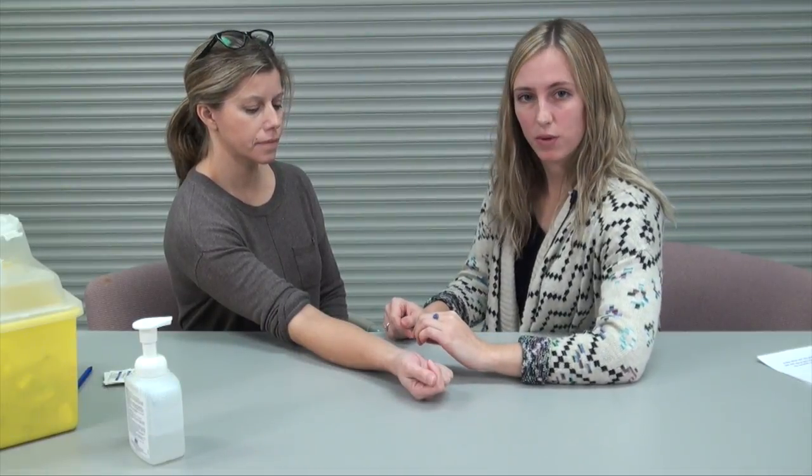Once it's time to read your tuberculin skin test, you want to make sure it's been 48 to 72 hours before doing the reading. The first step is to locate where the skin test was administered.